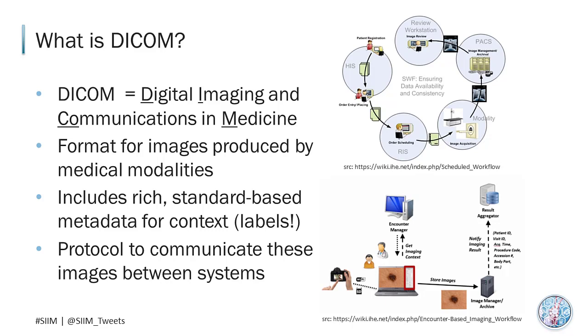Medical images can be captured in the scheduled workflow, such as those in radiology, or as part of the patient encounter, such as in dermatology. In both cases, they are standards-based workflows that produce DICOM objects. And these objects are embedded with a very rich set of metadata, such as the patient context and the procedure information. This additional data, along with the pixel information, such as rows and columns, is represented in the DICOM header, which can prove very powerful and useful for labeling.